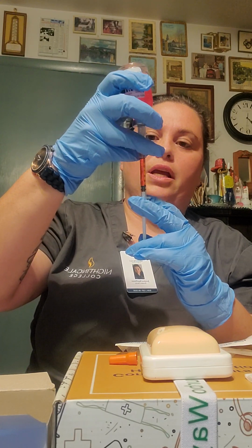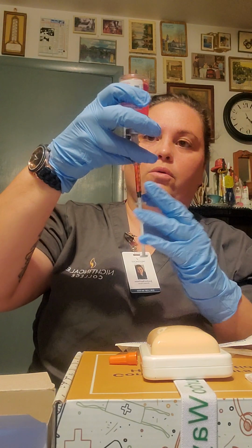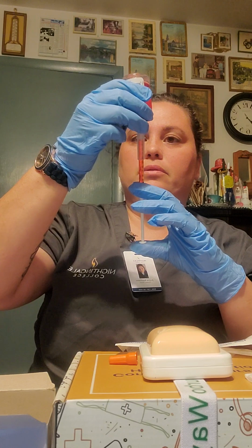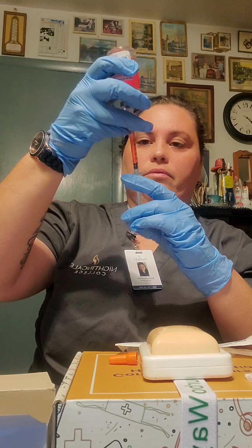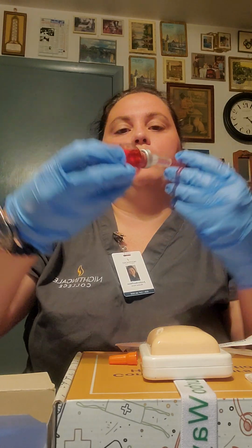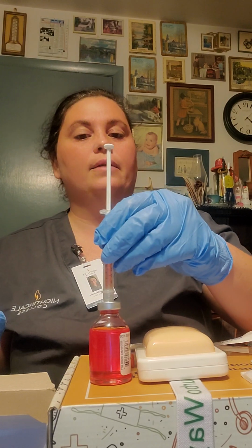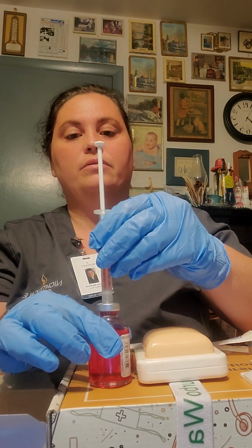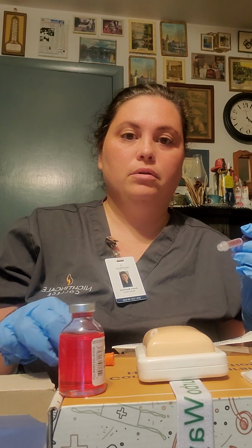Okay, if there were any air bubbles, I would flick them out, or I would push back up and then withdraw some more of the med out. I'm going to flip it back over. Alright, I then am going to pull this straight up and out. Okay, I'm going to move this out of the road so you guys can see.